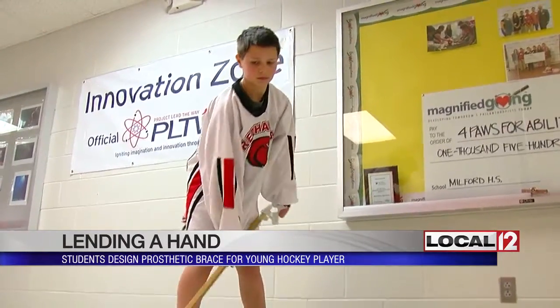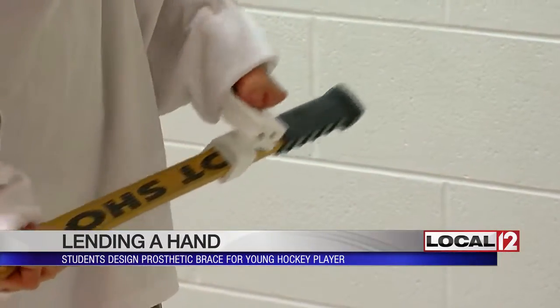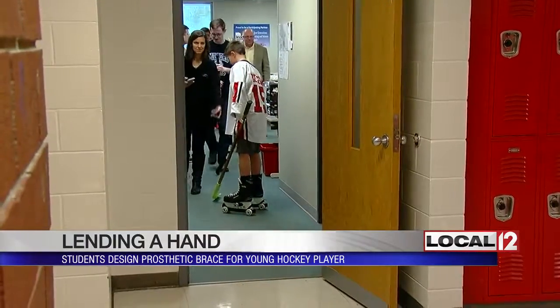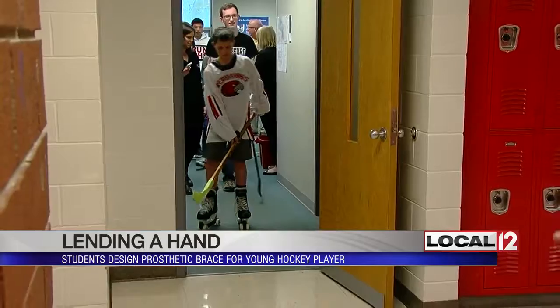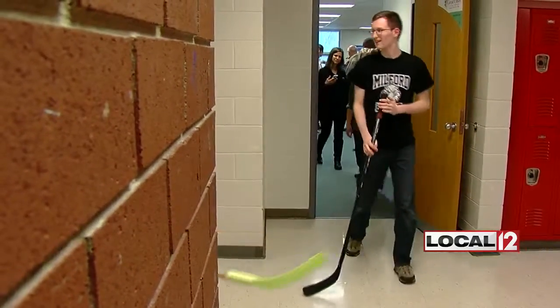Connor says he and the students will continue to perfect the brace. Gabe noted it's always on one side so he can't toe drag, but that doesn't really matter because he's defense. What matters is the help Gabe is getting from some smart students who understand the passion he has for playing just like any other kid.